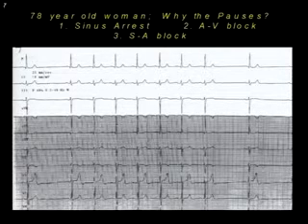So an elderly lady who's again having pauses is question number 9. 9A, sinus arrest. 9B, AV block. 9C, sinoatrial, SA block. Start sending your SMS. 9A, 9B, 9C. 10 seconds to go. Everyone send them? Anyone remaining? Okay, we are done. Stop receiving.